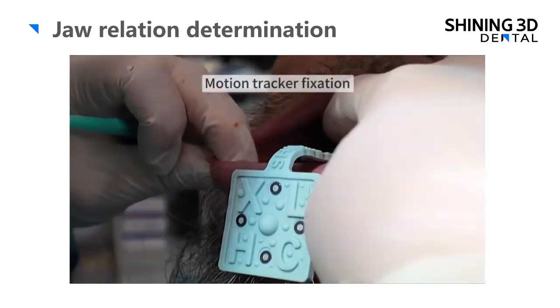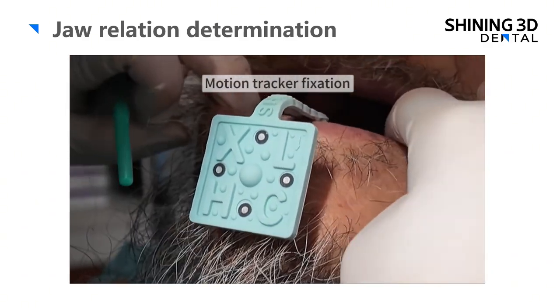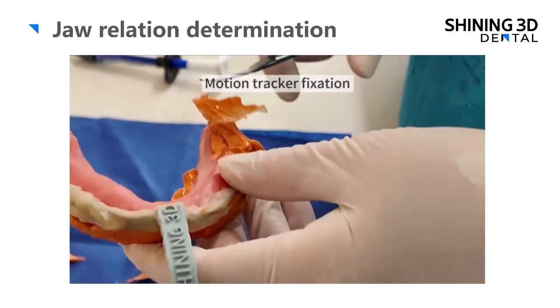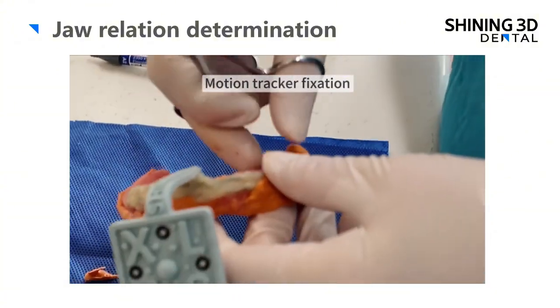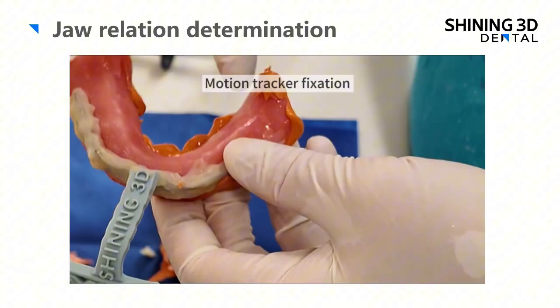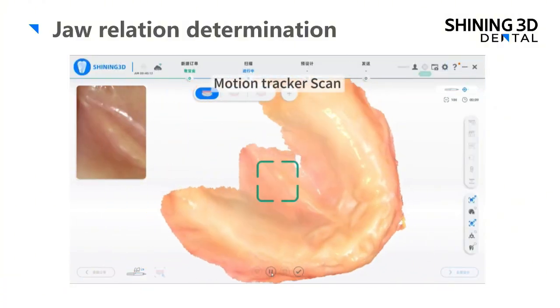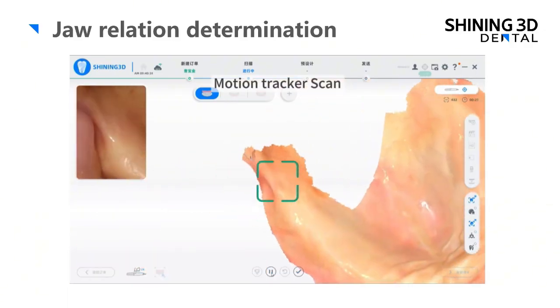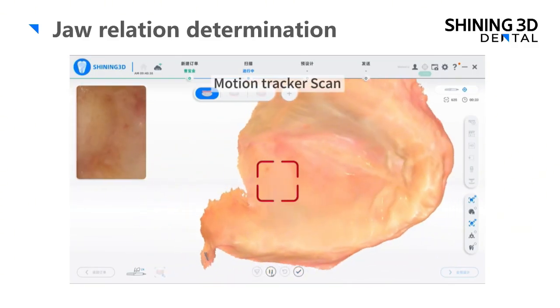So we are repeating the same steps to press it down to the patient's lower jaw, and once it's cured, trim the materials and the trays to increase comfort while putting it inside. Then we can do an extra match for the motion tracker, and this is for the upper jaw scan.